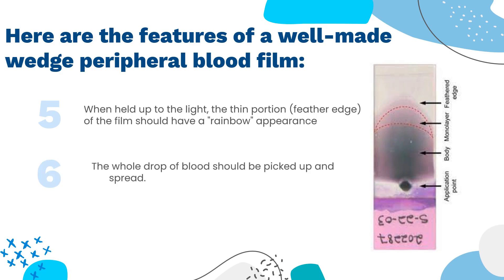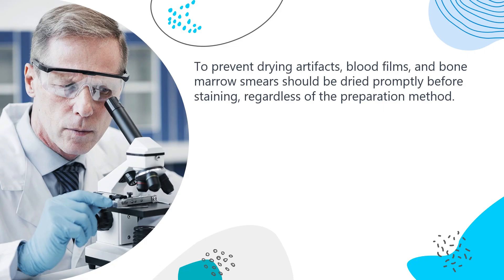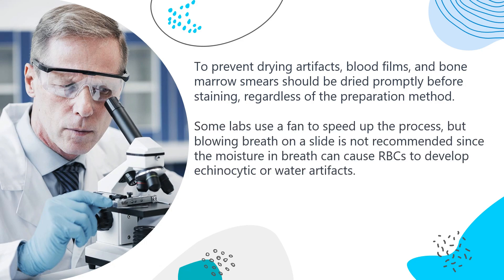6. The whole drop of blood should be picked up and spread. 7. To prevent drying artifacts, blood films and bone marrow smears should be dried promptly before staining, regardless of the preparation method. Some labs use a fan to speed up the process, but blowing breath on a slide is not recommended since the moisture in breath can cause RBCs to develop echinocytic or water artifacts.